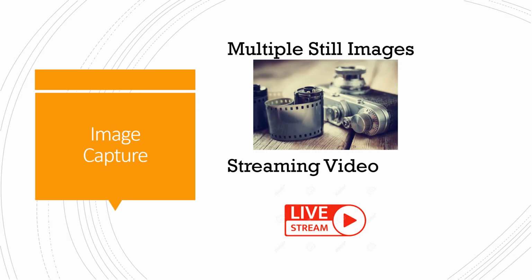Image capturing. I kind of already spoke about this a little bit. There are 2 methods. Older scanners capture images by taking multiple still images and stitching them together with the software, but newer scanners use streaming video to capture images of the teeth and those surrounding structures.